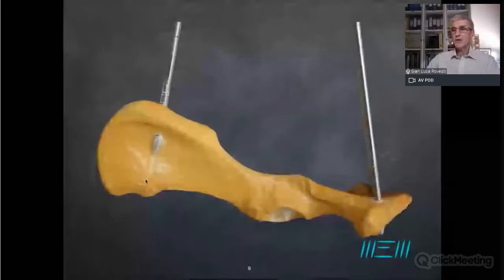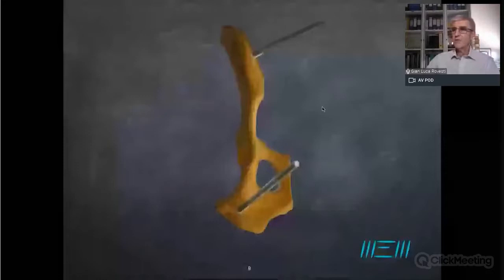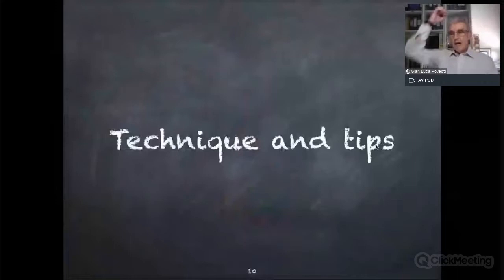And at the end, we will add this kind of distribution for the pelvis, for the hemipelvis. It can be the same on the opposite side, and we will see why, in order to have good purchase of the threaded pin in the hemipelvis. So, technique. We need a good positioning of the patient.